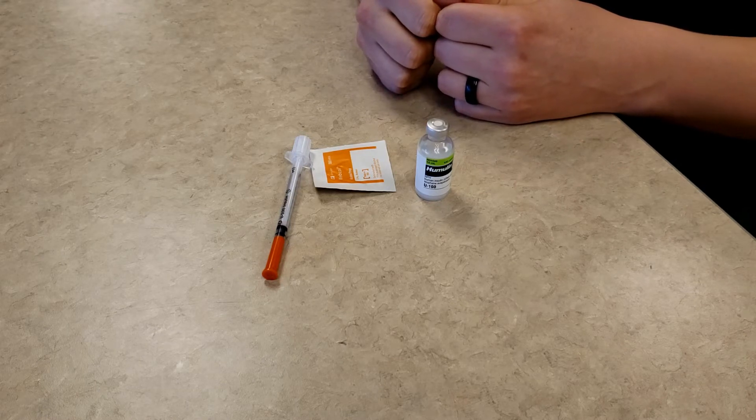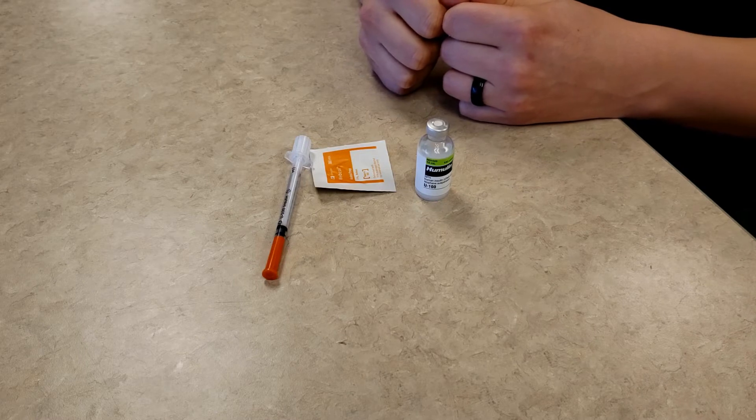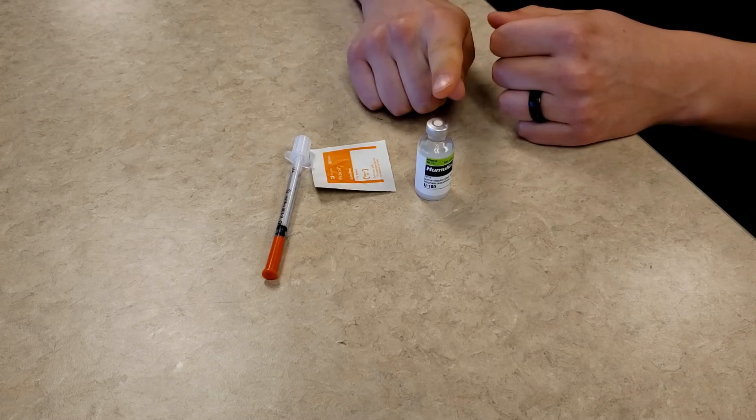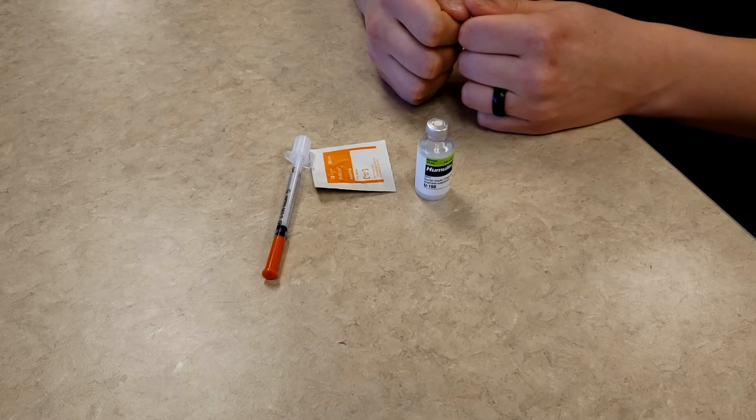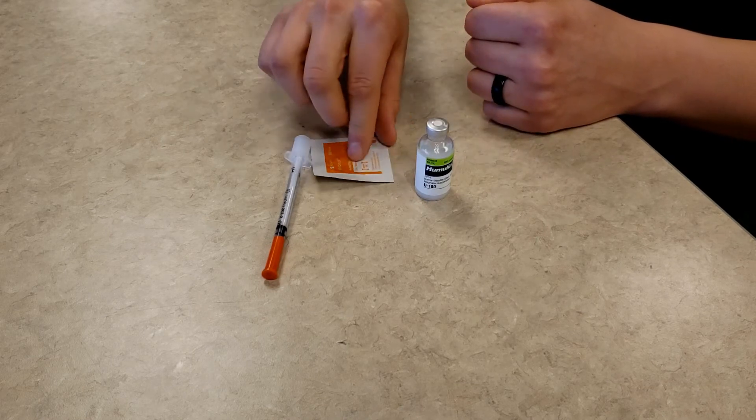For this demonstration I am going to measure and inject 14 units. The first thing you need to do is take the alcohol wipe and sanitize the top of the insulin bottle.